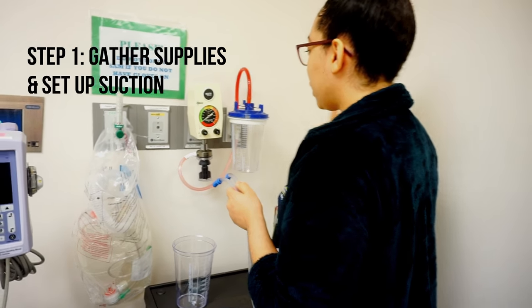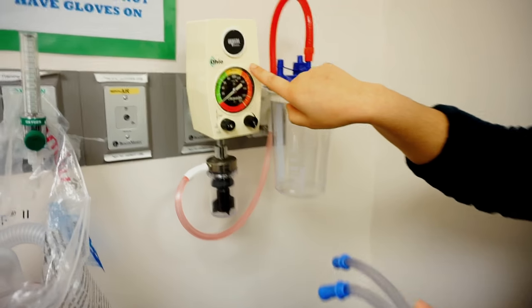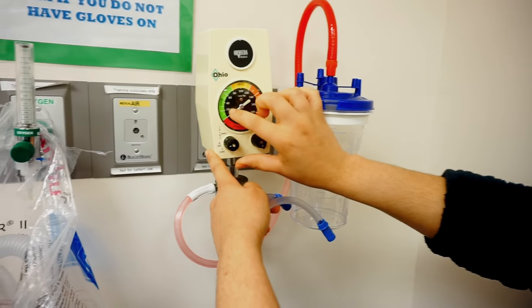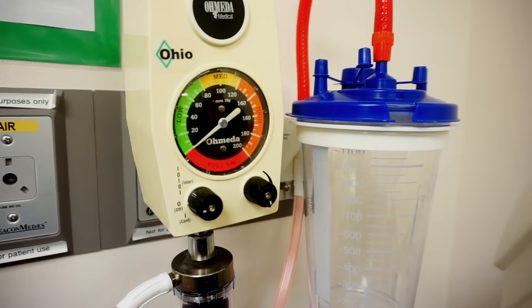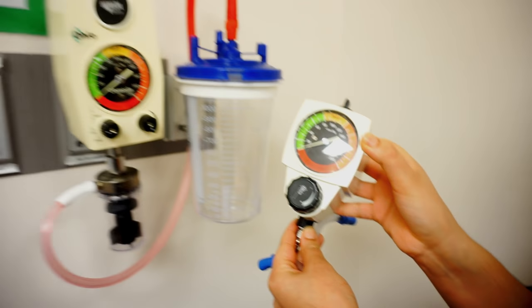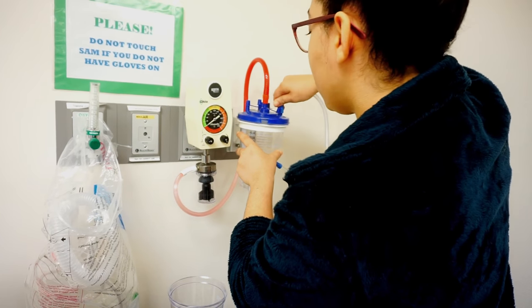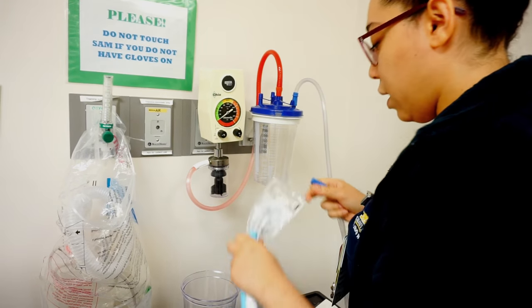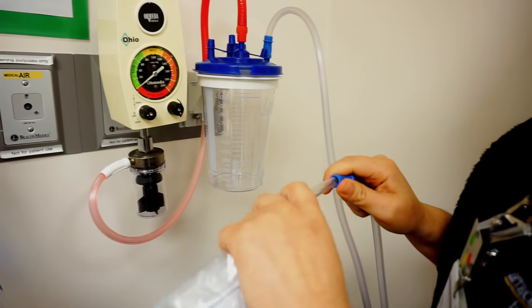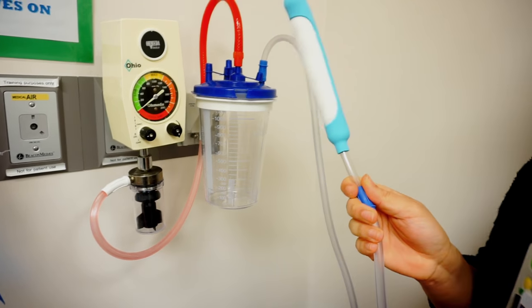You're going to attach your canister to wall suction. Make sure that you specifically use this suction — it has to be on continuous low suction at 40. Do not use the mech suction; absolutely do not. Set up the canister, make sure that it works, attach the Purewick like so, and then you are ready to place it on the patient.